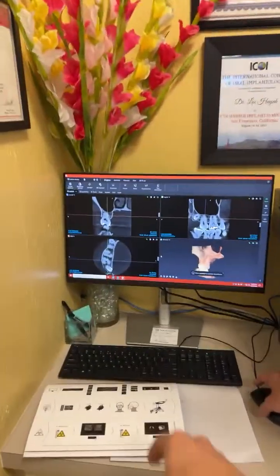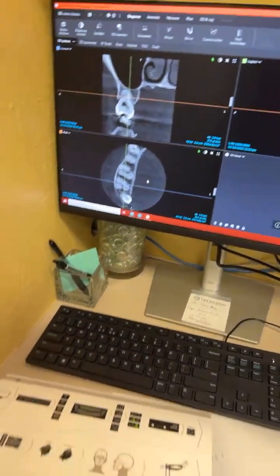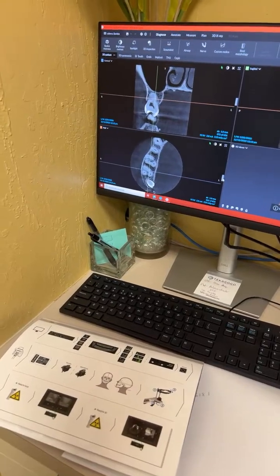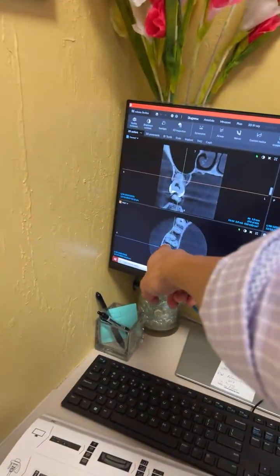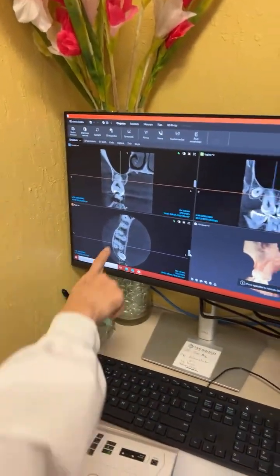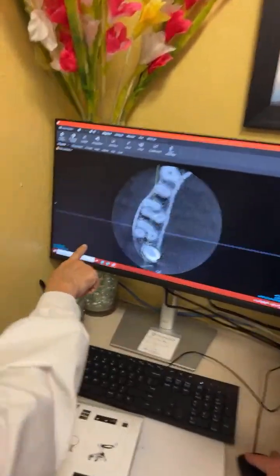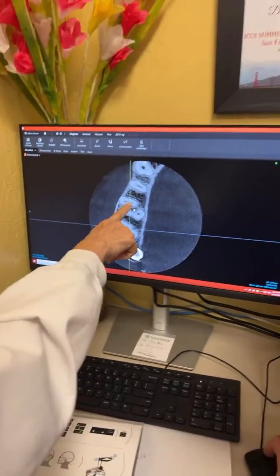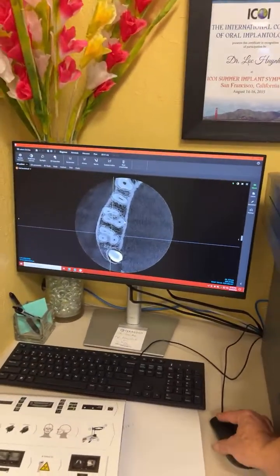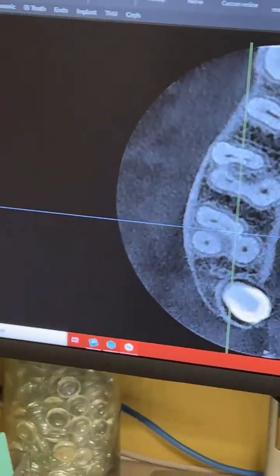I like this the most. I like this root part here. So which one is for root canal? Yeah, right here. This one you study, how many canals before you do it. I see. Without this, you don't know how many root canals you have. Oh wow, yeah. One, two, three. Where is four now? Right here. One, two, three, four. Here? Yeah, you can see them. Wow. Okay, guys, I'm giving up endo now. I'm not doing any more endo.